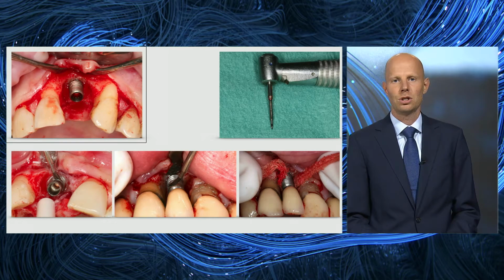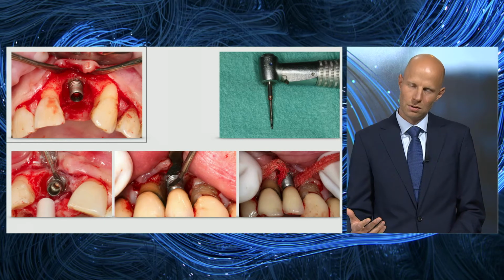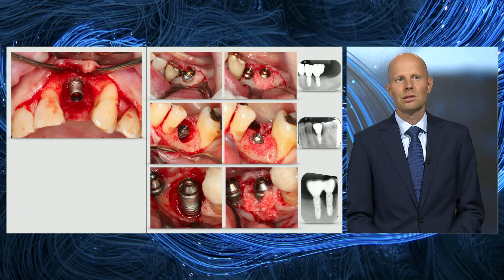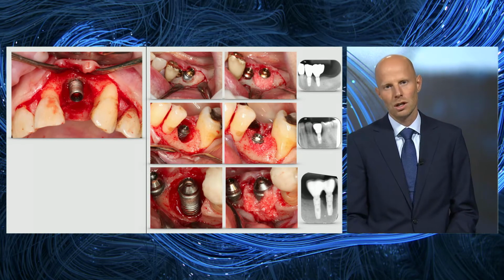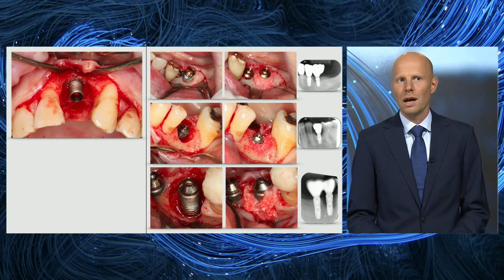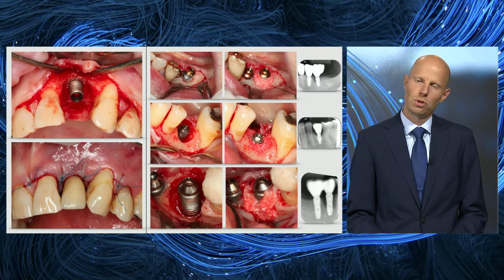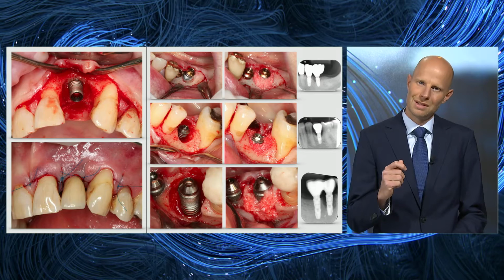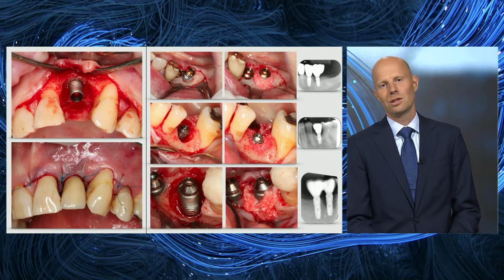Following this decontamination, we have to make a decision as to whether we want to graft or not in this particular case. And to your right, I am indicating some examples where we choose to graft, and I will discuss with you the concept of whether we should or should not graft in a minute. After grafting, we close the case and then also place the superconstruction back on the implant. Removing the superconstruction during surgery tremendously facilitates the procedure. So whenever possible, this is what we do.